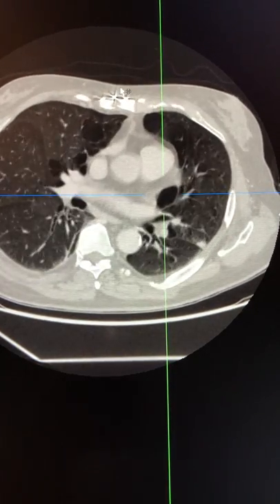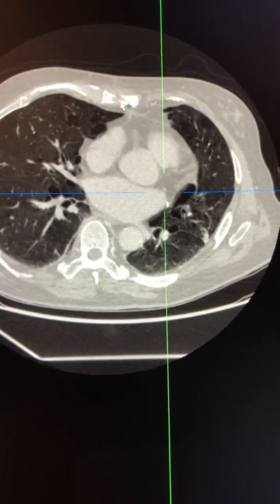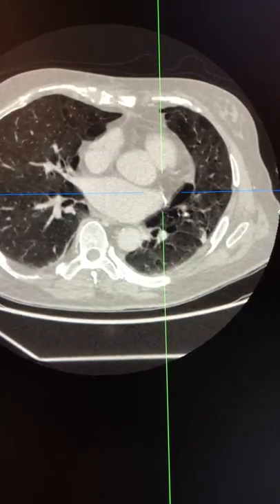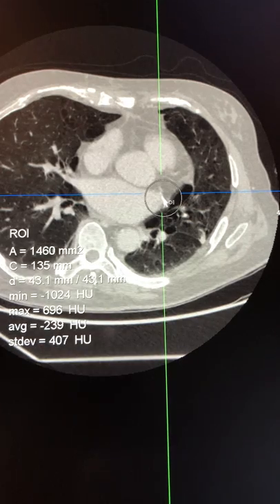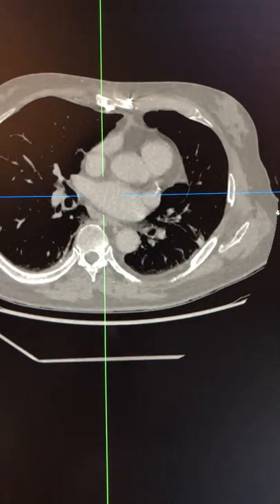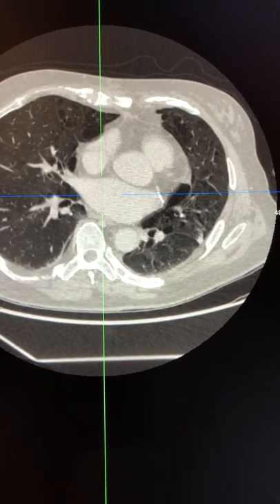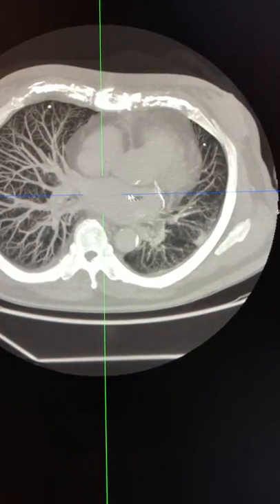This video explains a surgical procedure performed for control of atrial fibrillation. Your attention is now drawn to the highlighted structure here, which comprises the expected position of the left atrial appendage. If we examine the image, you can see that there is a suture-like device in this location.